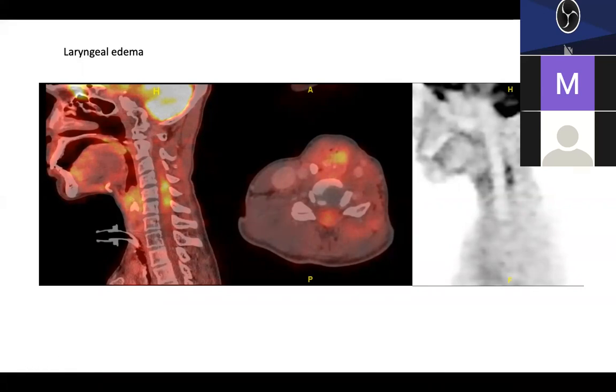So in this patient, they did a biopsy also, and that came negative, and post-RT necrosis came. After that, they sent the patient back. Then the patient came again after 2 more months. So this is that scan. So here you can, so Avi, now the patient's presenting complaint is partial bilateral upper and lower limb paralysis.